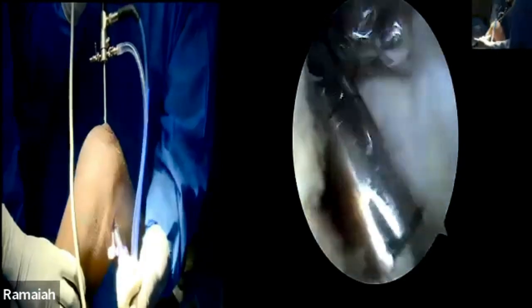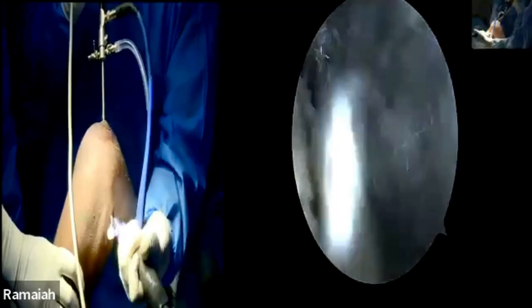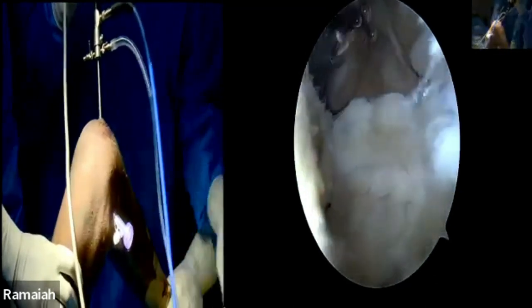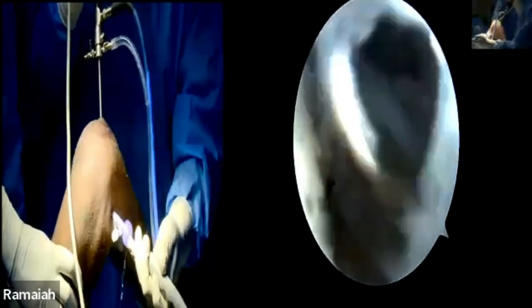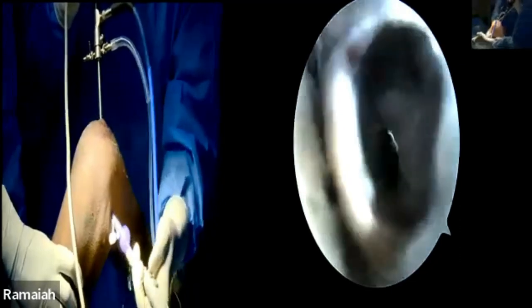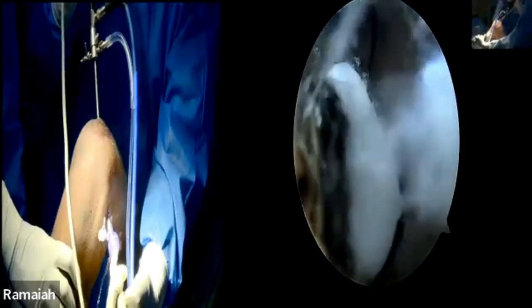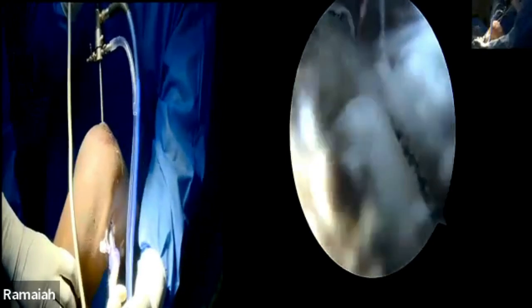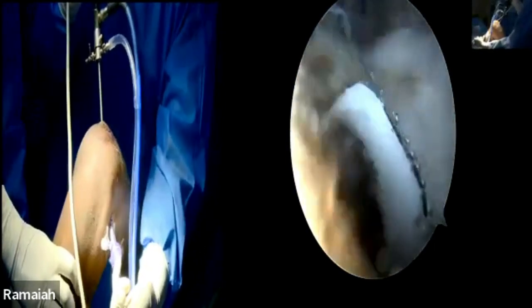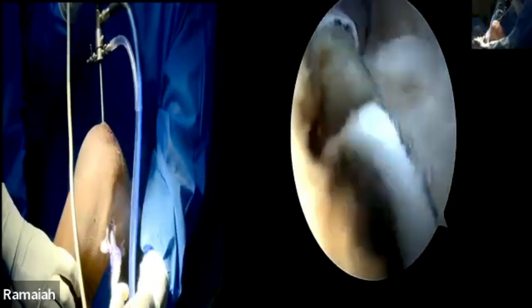You can't see completely but you can definitely feel. If you are planning to take out the complete PCL it's no issue — you can also use radiofrequency in between. That preparation is quite clear. That is the upper surface of the tibia I am touching upon. Now after some preparation I'll shift my telescope to the cannula I have already placed.